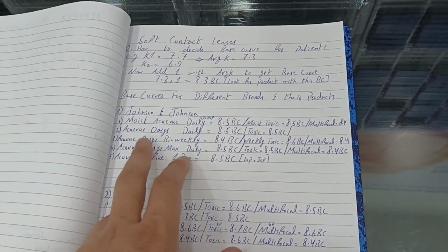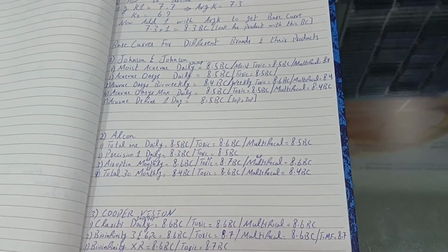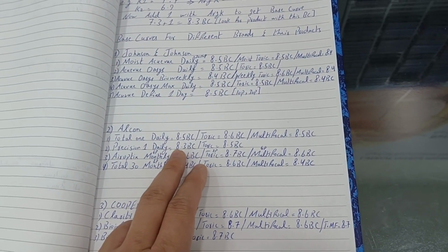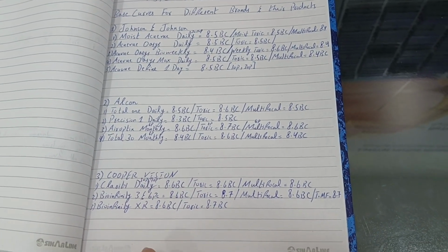So as you can see, in Johnson and Johnson we cannot find any single contact lens which can be prescribed to the customer or the patient. In the Alcon, you see the Precision One daily contact lenses has a base curve of 8.3. So this daily contact lens is one of the best that we can prescribe to our patient.